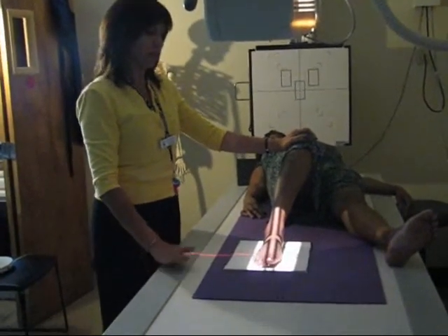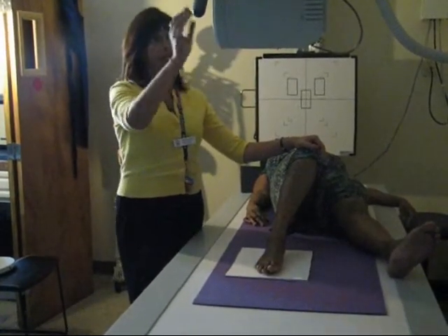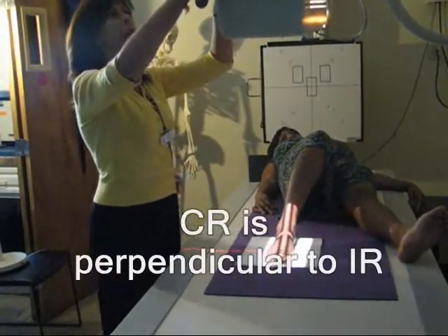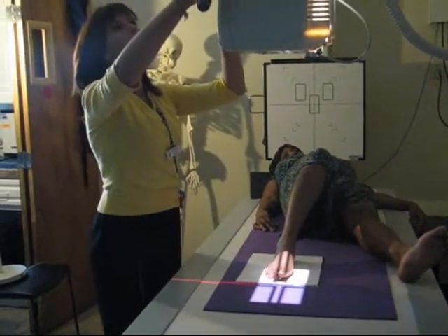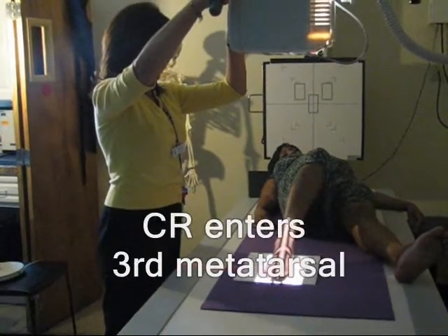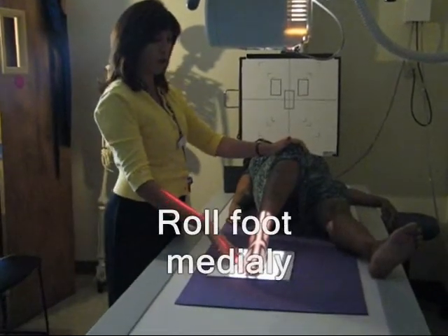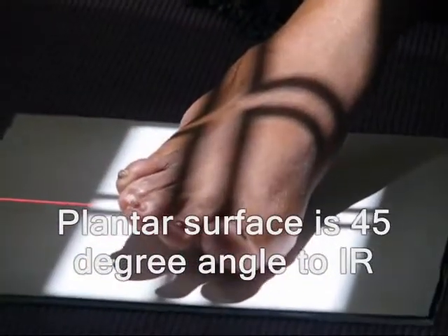Continuing with the study of the foot, our next position for routine visualization of the foot is the oblique position. Still SID at 40. The only difference now is you do not have an angulation anymore, so we're going to roll it back to perpendicular and bring it back to the third metatarsal, and we're going to have the patient roll their foot medially about 45 degrees. Pause the video and review the procedure before continuing.